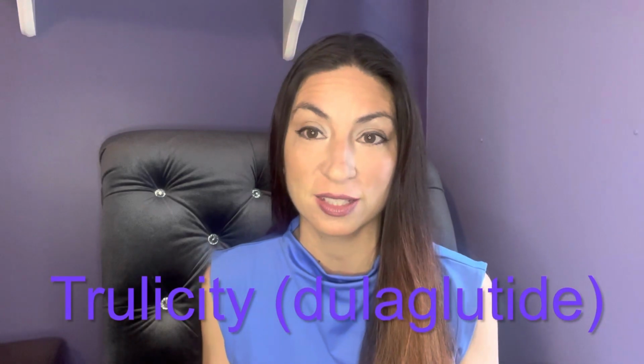Today I'm going to be talking about Trulicity and how to do the injections. So, Trulicity is a glucagon-like peptide agonist. It is used in patients with type 2 diabetes to help control blood sugars in conjunction with diet and exercise.